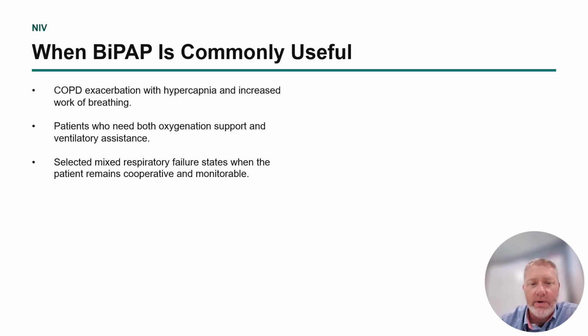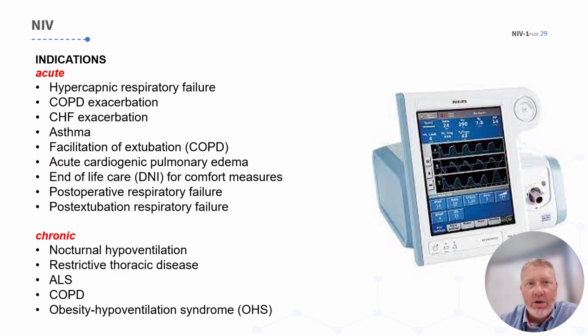But mainly it's for your COPD patients and pneumonia patients, people who have both oxygen and ventilation compromises.